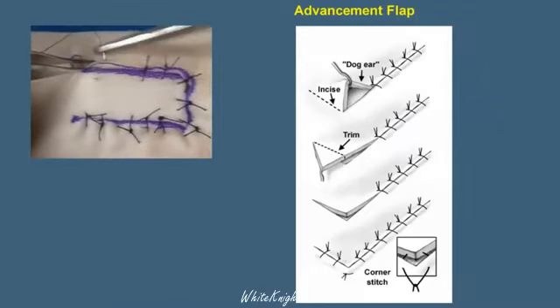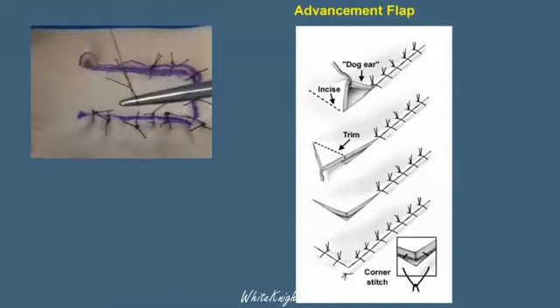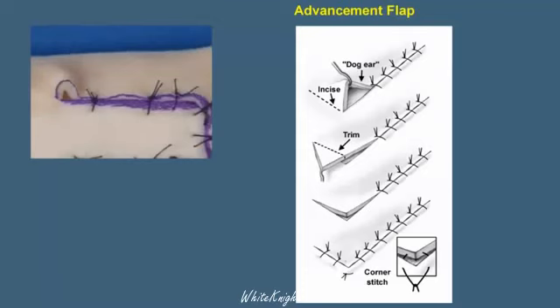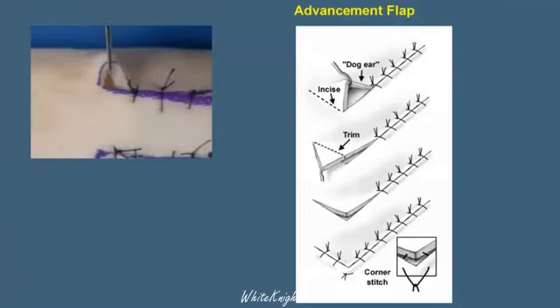On the upper flap, we have closed it so that the skin is closed in an even manner, resulting in a standing cone deformity at the inferior aspect of the flap. The standing cone deformity excision is always done away from the flap pedicle.